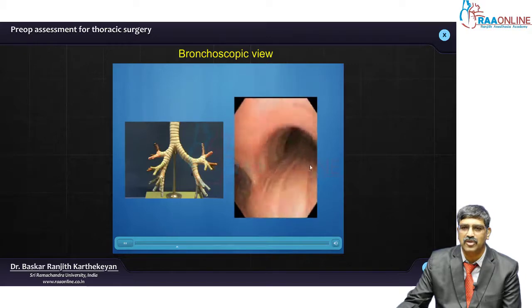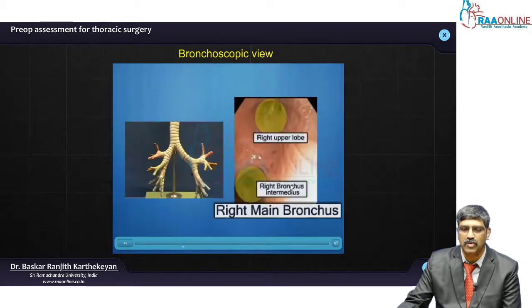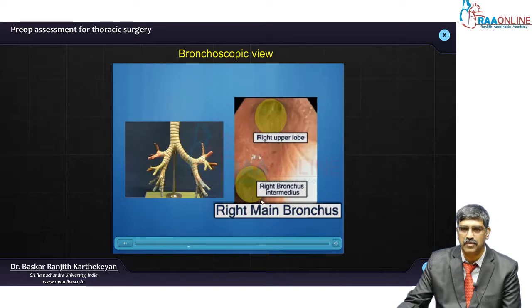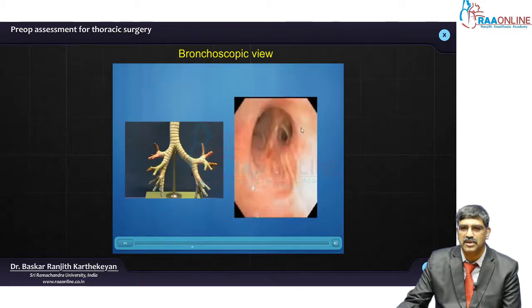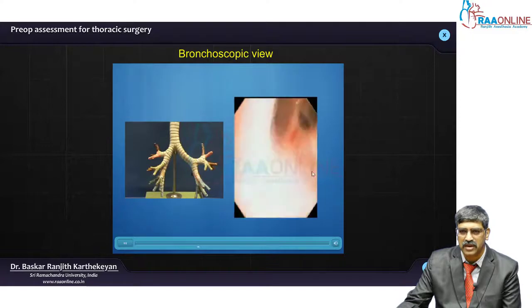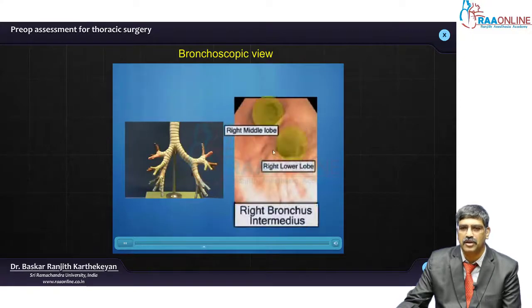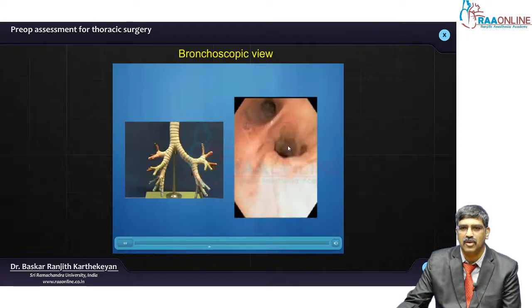As you enter into the right main stem bronchus, here you can see 2 divisions happening: the right upper lobe and the bronchus intermedius. The right upper lobe is the difficult part to ventilate — here you can see 3 sub-segments. And in the bronchus intermedius, you can see the middle and the lower lobe.